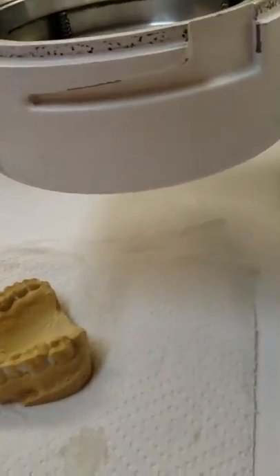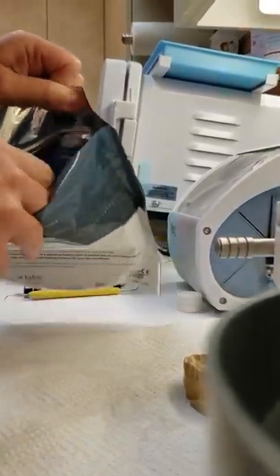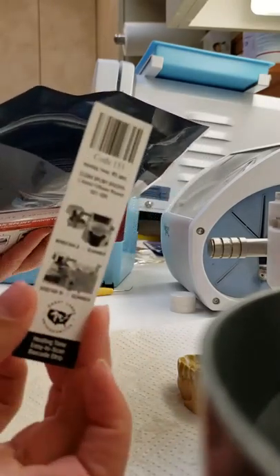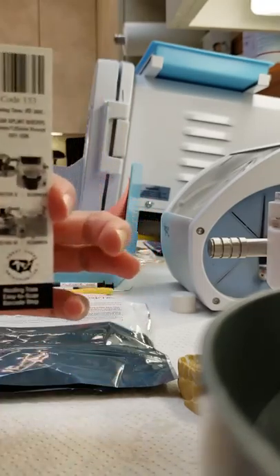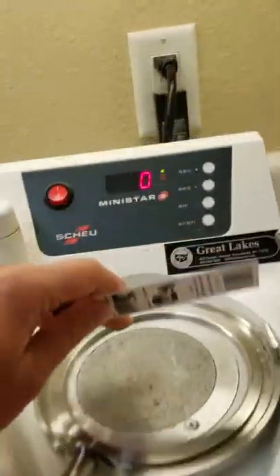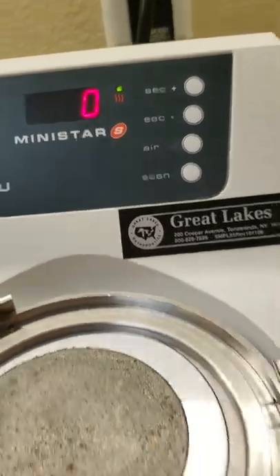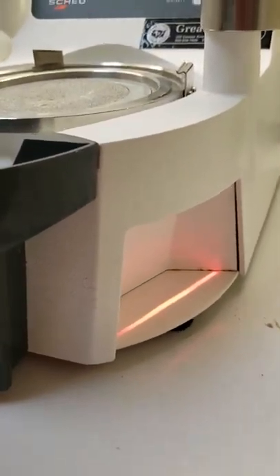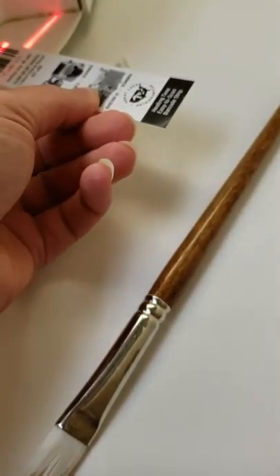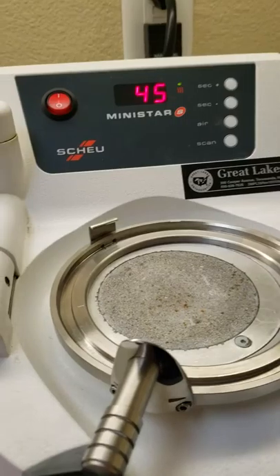Make sure you reseal the bag. Inside the bag there is a barcode — you have to dig it out, so make sure you put everything back. This barcode scans into the Ministar: hit the 'scan' button and a barcode light comes on. Scan the barcode, you'll hear a beep, and it automatically sets your time for the Essex tray.